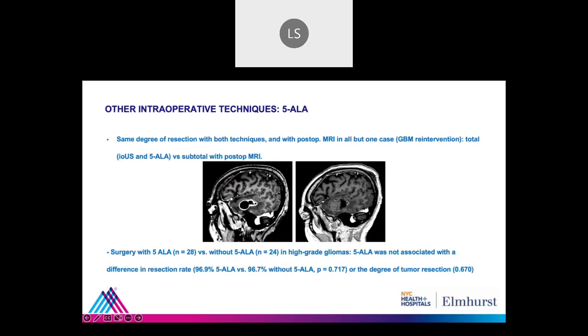Then we compared the surgery with 5-ALA for high-grade gliomas with the patients that underwent surgery for a high-grade glioma without 5-ALA, and we compared the resection rate.